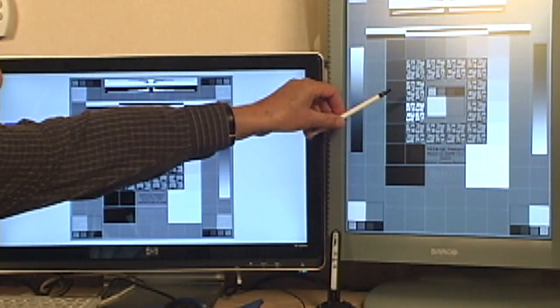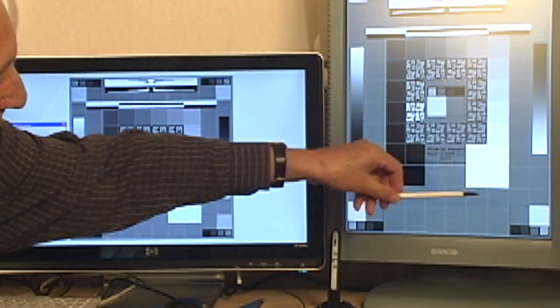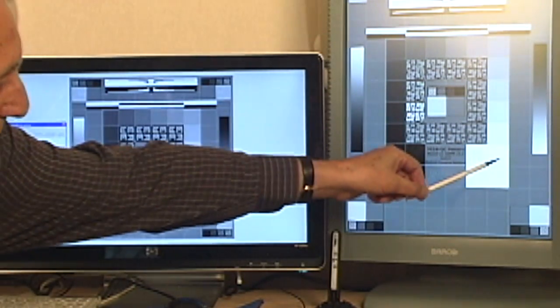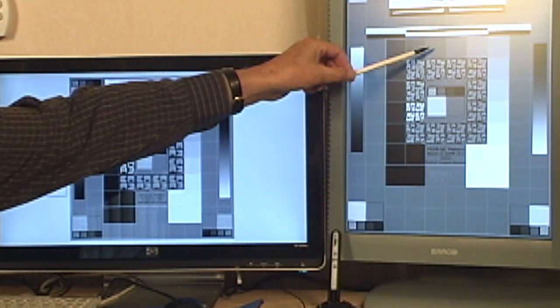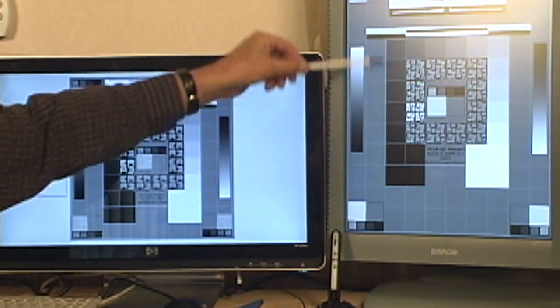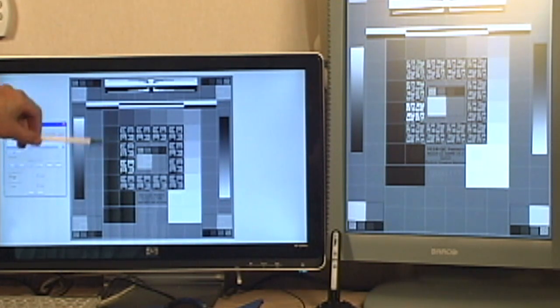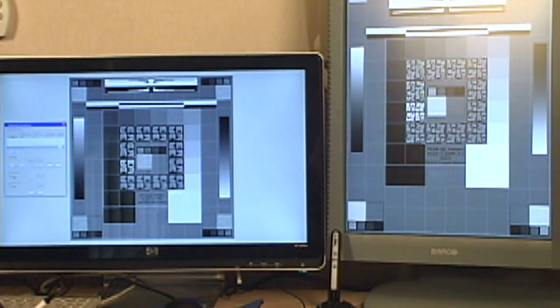What we did different from the SMPTE is with these squares that go around this outside area, grayscale blocks of increasing luminance. This is not black and this one's not 100%. This one starts at the 8-bit level, and this one stops at 248. So there are 8-bit differences between these digital driving levels. When you look at this, you see a very distinct difference between each one of these squares, which is all well and good. On most commercial displays, like this 1,000 line, 2 meg, HD format display, you can see a difference between all the squares. They're fairly good, and there's a nice difference between the 5 and the 95%.